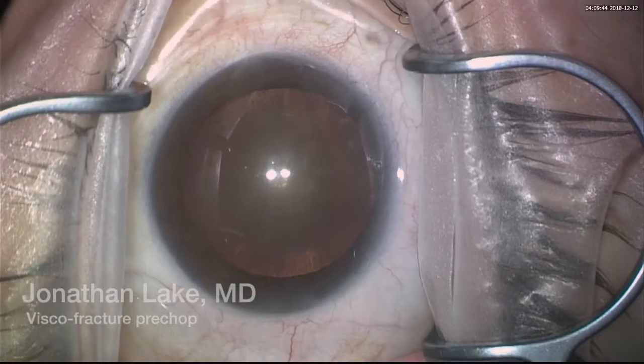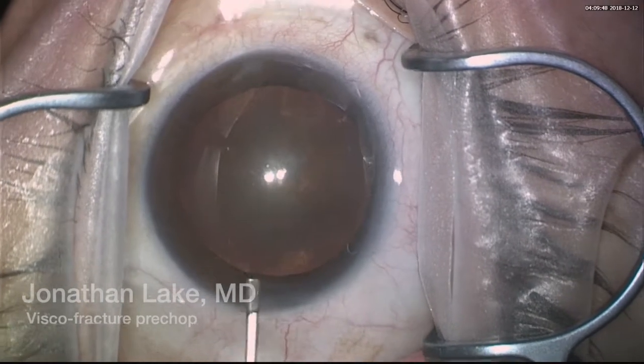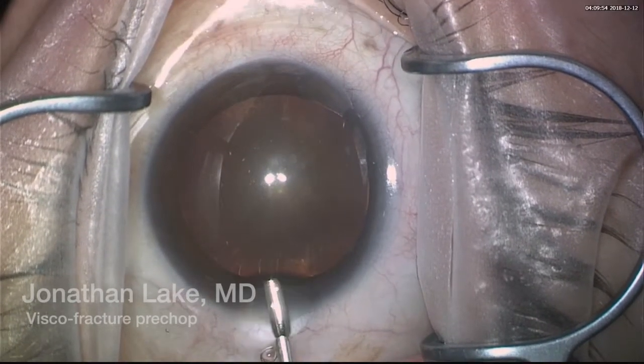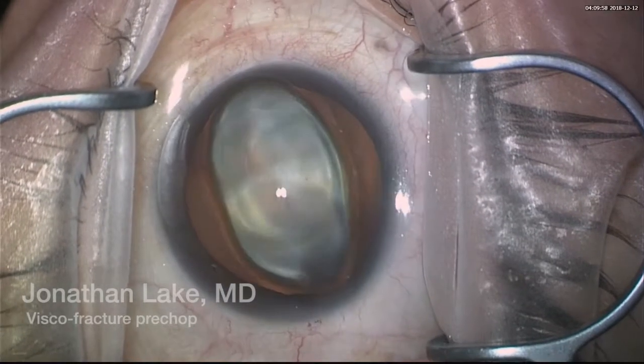Welcome everybody. I'll be talking about a one-handed phacoemulsification technique using the very elegant technique described by Gustavo Malavazzi in 2011 for the JCRS. Basically I'm using a dispersive viscoelastic a little bit on top of the cornea so I don't have to constantly irrigate.